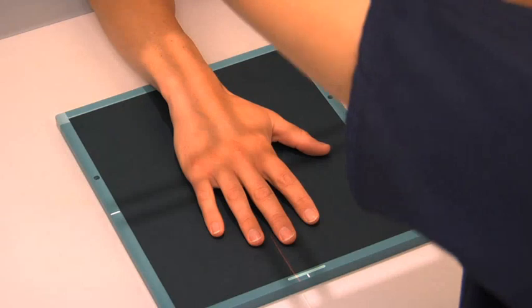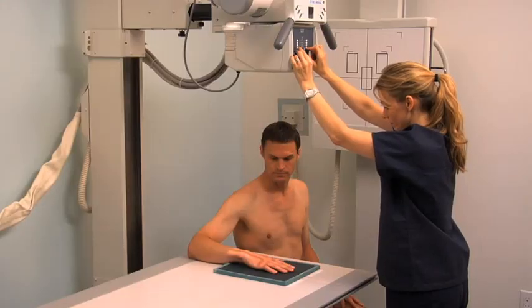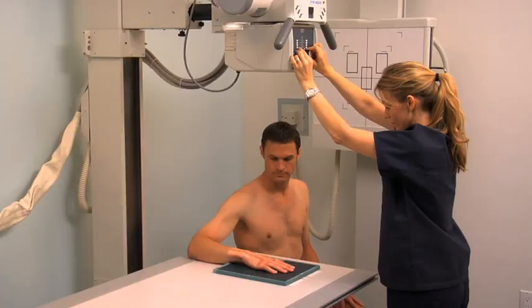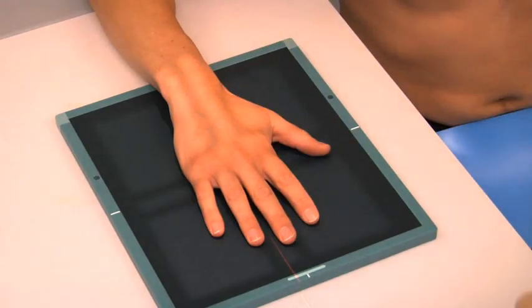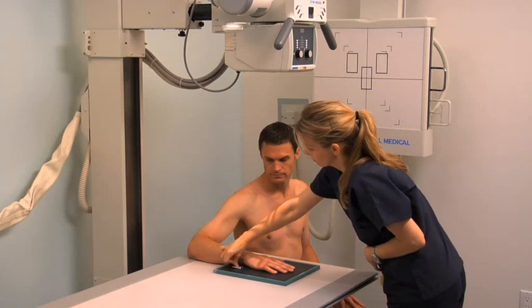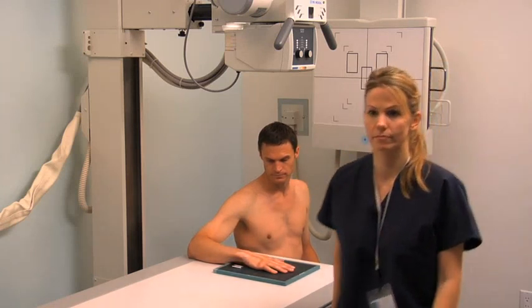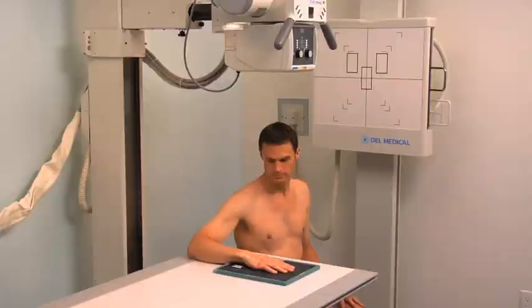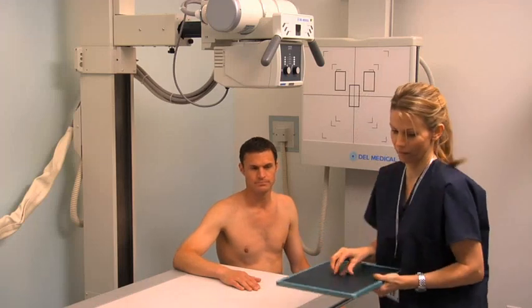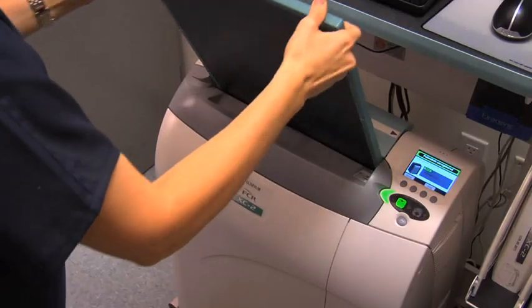Center the central ray to the third MCP joint. Collimate to include the bony and soft tissue anatomy of the fingers, hand and wrist, and the distal radius and ulna. Place the correct lead marker in the upper corner of the image and instruct the patient to remain still. Stand behind the protective lead barrier and expose the cassette. Remove the cassette and process it while preparing for the next projection.